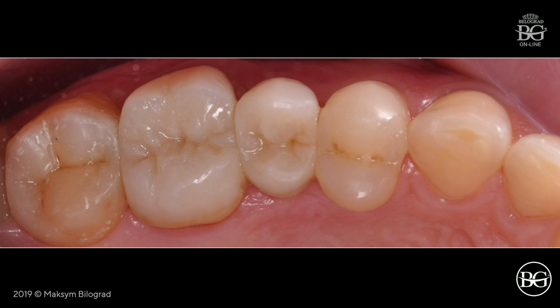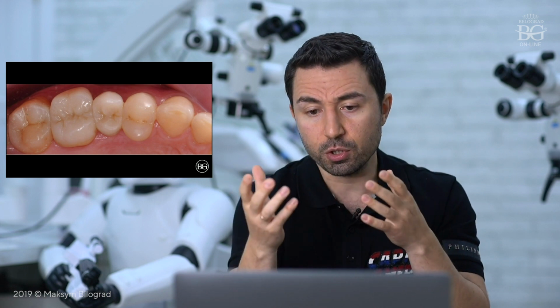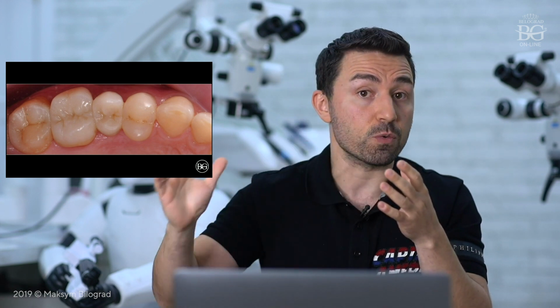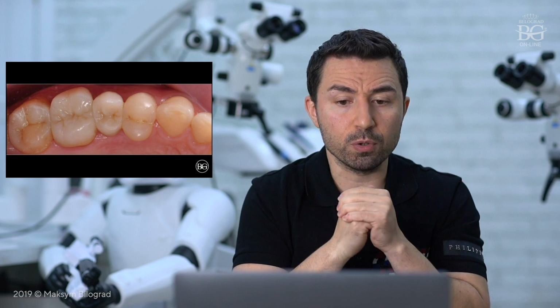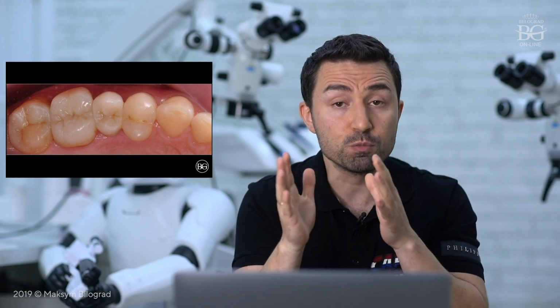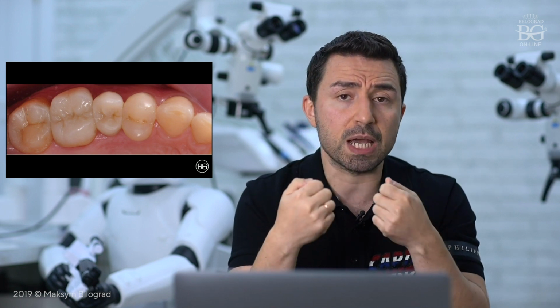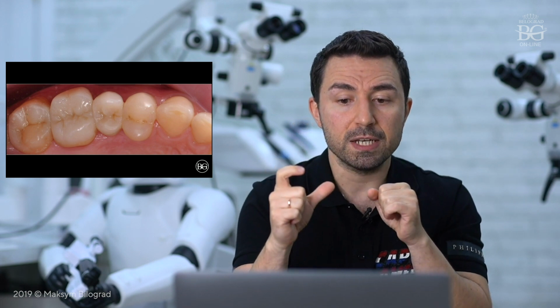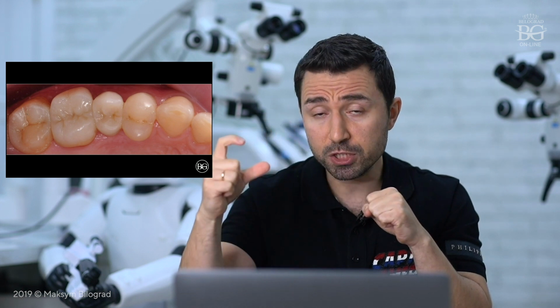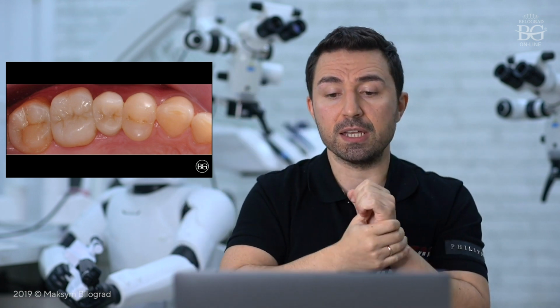interdental spaces. So if you need to add a little bit of amount, it's easy. But if you need to add a little bit more, you may do a few tricks. You can do restorations one after one, and adjacent teeth will be covered with a Teflon tape, for example. Or you can make some customized matrix systems to put between teeth. But still, you may have excess, and you will spend some time removing this excess from interdental spaces. You can do individual, customized single tooth stamps, which will be more accurate, and you will restore one by one, and remove some excess.